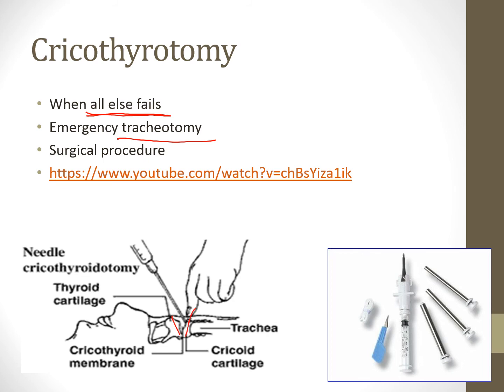Like I said, you were feeling that before on yourself. You can feel it again right now. They're going to poke through, and then they're going to put pretty much this IV part there. Now, there's special parts they make for this, but they're going to poke through. Here they have the little scalpel and everything. Poke through, and then we're going to put this sort of temporary airway in and allow for some ventilation.